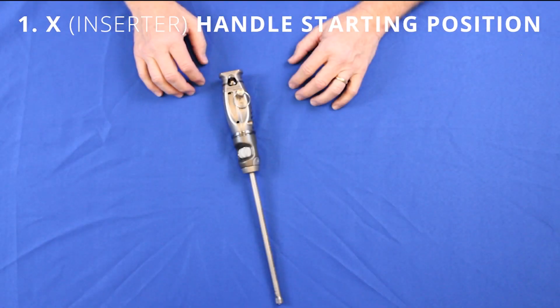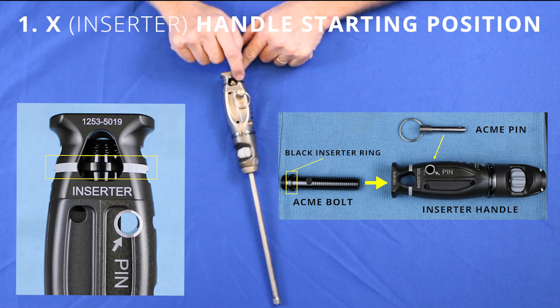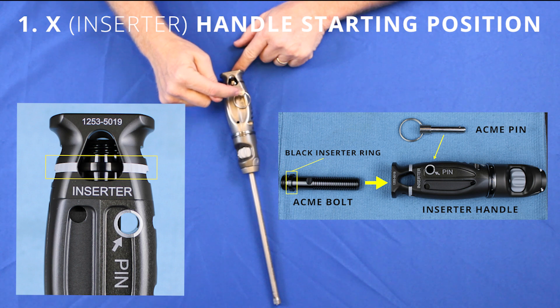Setting the X-Handle to the starting position goes as follows. The Acme bolt has a ring that is lined up with the laser mark on the handle. That's your starting position and is held in place with the pin.